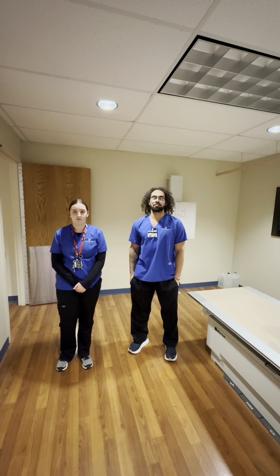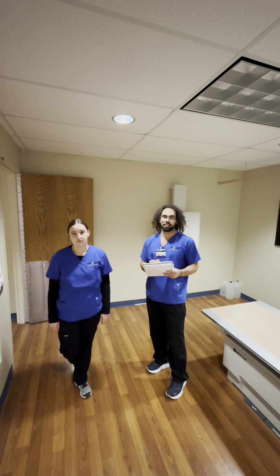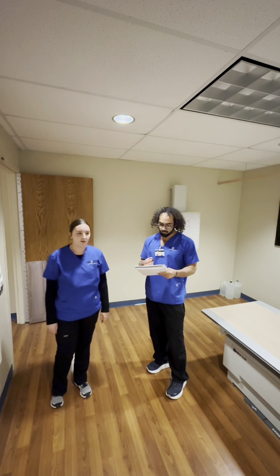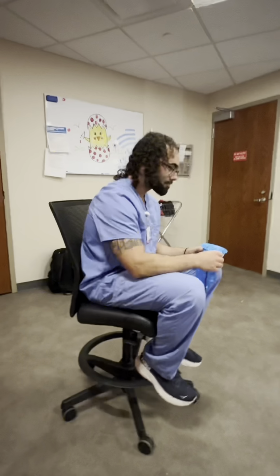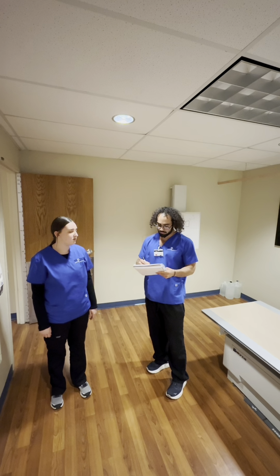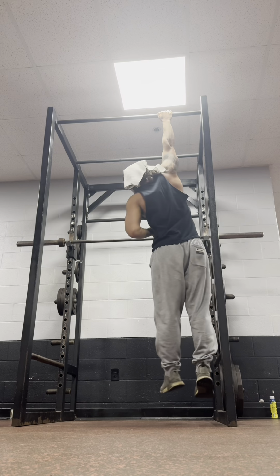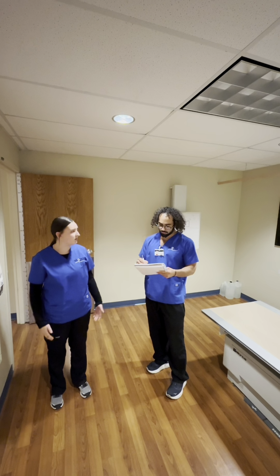After preparing your patient for the exam and using your patient identifiers, you're going to want to ask them the history and why they're here to get the exams today. I've had a cough for about 3 weeks with mucus. Shortness of breath. Been feeling really tired for the last couple weeks.